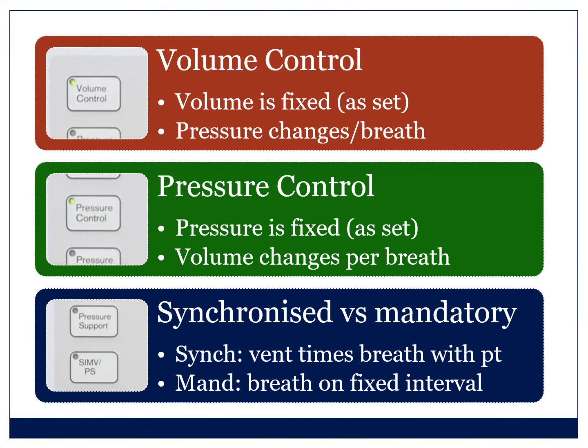The other concept which is worth thinking about is whether the breaths you're delivering are synchronized or mandatory. With synchronized breathing, the ventilator will time a breath with a patient effort. It will detect that the patient is trying to take a breath, and it will synchronize either the pressure or the volume it wants to deliver to that breath from the patient. It will pick it up whether the patient starts taking a breath by detecting negative pressure, or that the flow from the patient is going the other way because the patient's drawing in, so a negative flow. That's called the trigger, and detecting that will then result in the ventilator supporting that breath. That's called synchronized ventilation.